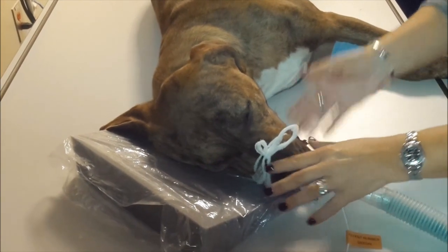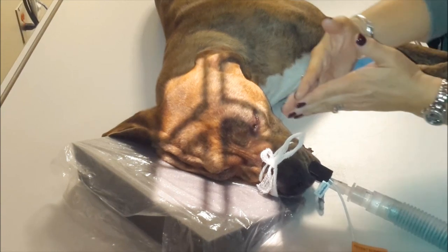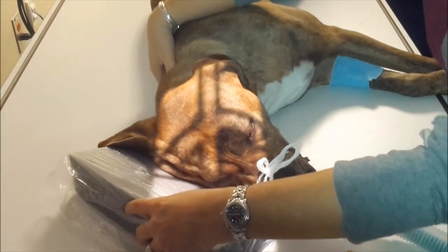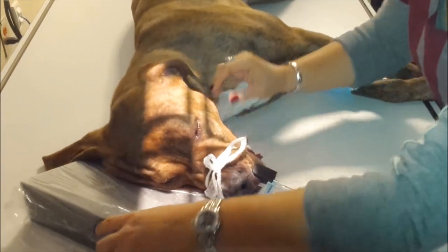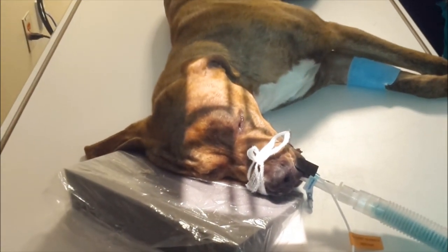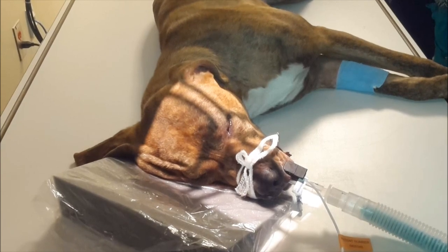So that's nice and obliqued. Our center — typically we want it to be at the medial canthus, but remember, it depends on the length of the nose. So we want our center to be there; we might have to move our dog accordingly. We want to go from the base of the skull to the tip of the nose, if we can. If you have this ability, turn that.